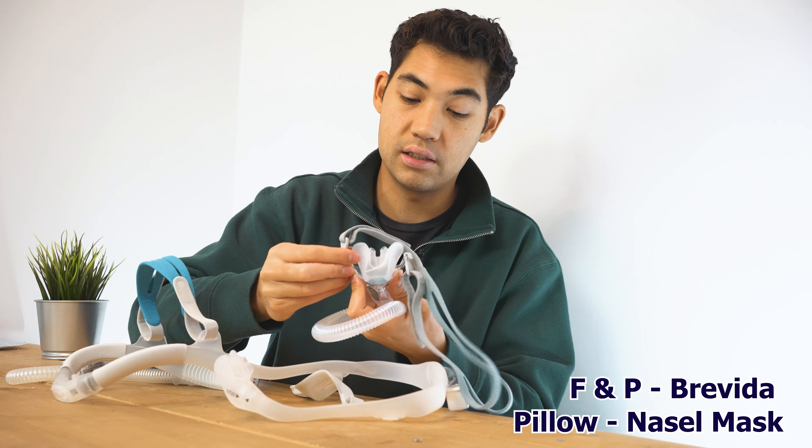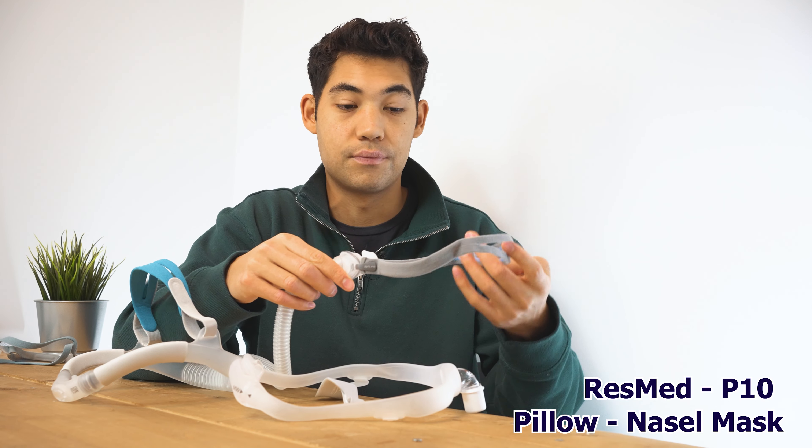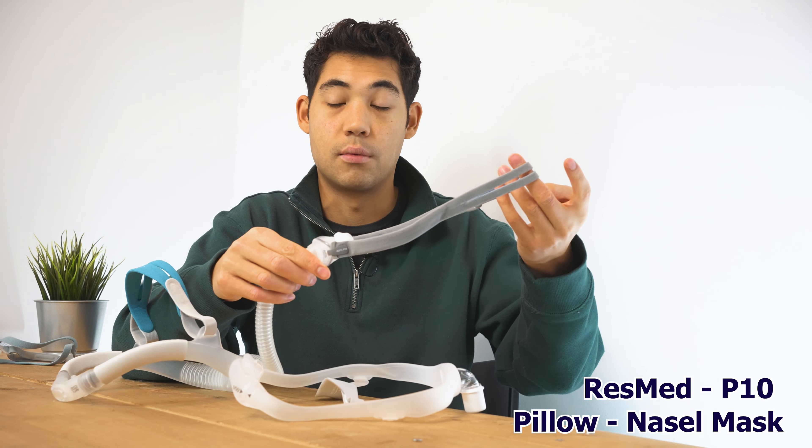The winner of the pillow category is the ResMed P10. It's an incredibly minimal mask and our clients consistently report great fitment and minimal leakage. What I really like is the bands inside that arc up around the cheek and over the ear — they don't dig into your ear. Despite being a very simple design, there's enough structure that it doesn't move around. The pillows are shaped well, they don't leak, and it's easy to travel with, store, and wash. Just a phenomenal mask.